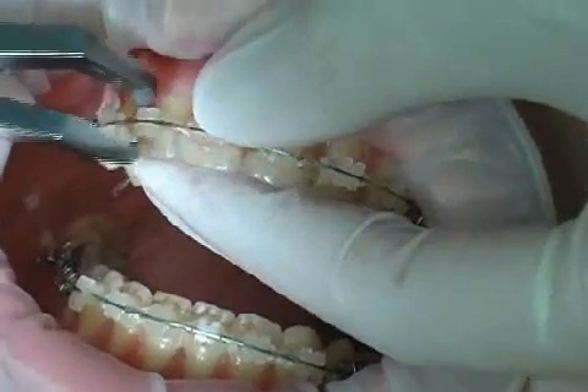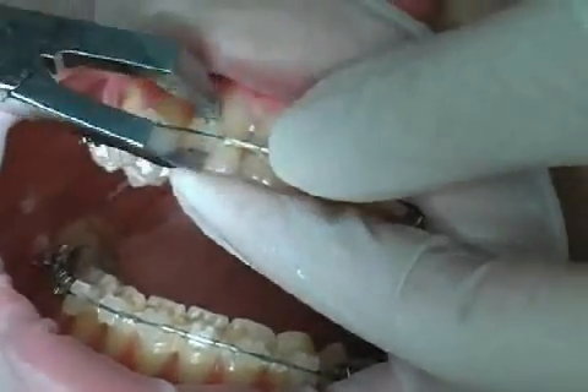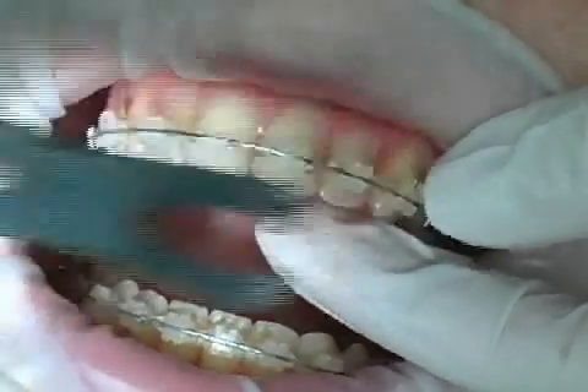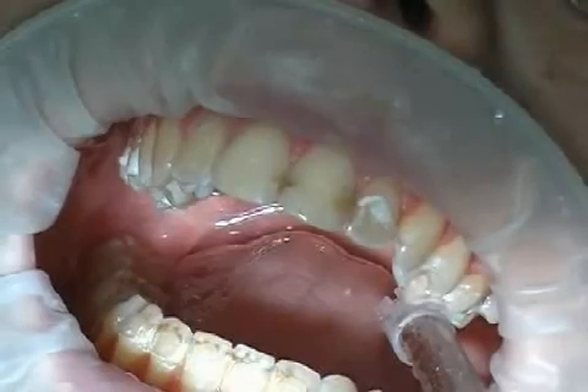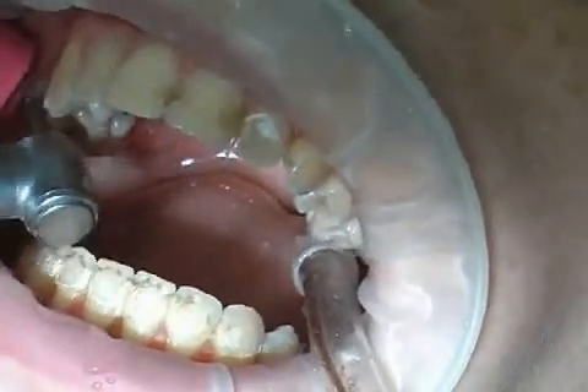The removal itself is pain-free, but the procedure can sometimes cause discomfort to the teeth. The brackets are removed from the teeth surfaces with special pliers. It is important that the bracket glue is removed entirely. This is usually done with a special grinder that removes the glue, but not the tooth enamel.